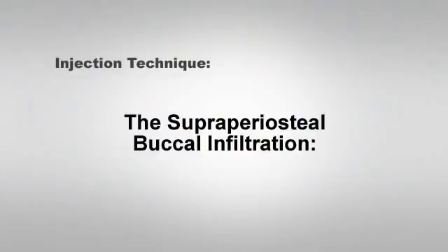The STA system is ideally suited for the administration of traditional injections like the buccal infiltration as well as the posterior superior alveolar nerve block. Let's discuss how to begin. Injection technique, the supraperiosteal buccal infiltration.